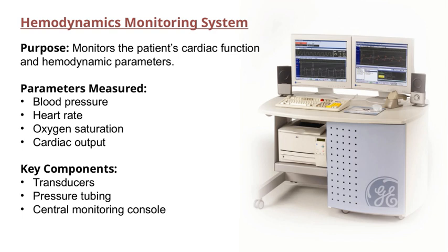the patient's hemodynamic status. Connecting all these parts together allows us to continuously assess and respond to the patient's changing condition, making the hemodynamics monitoring system a vital tool in critical care. It's an excellent example of how technology supports patient management and improves outcomes.